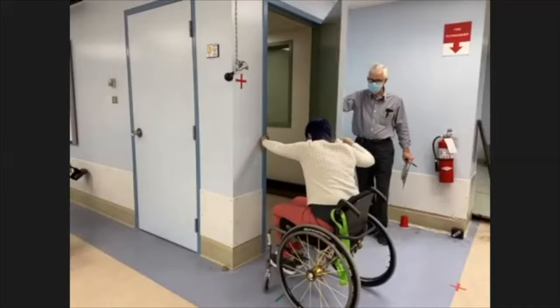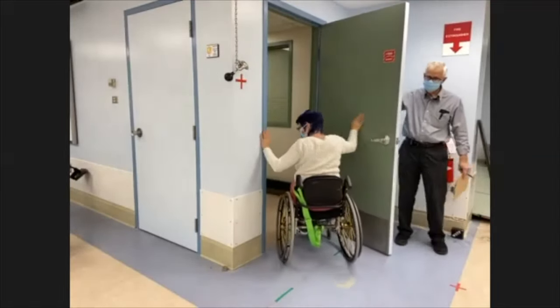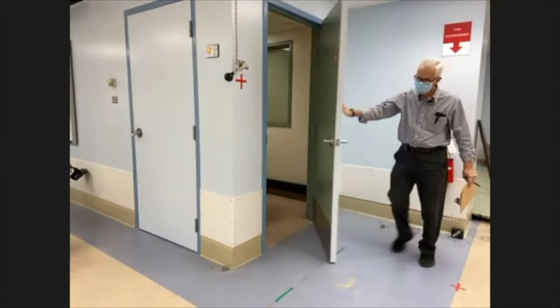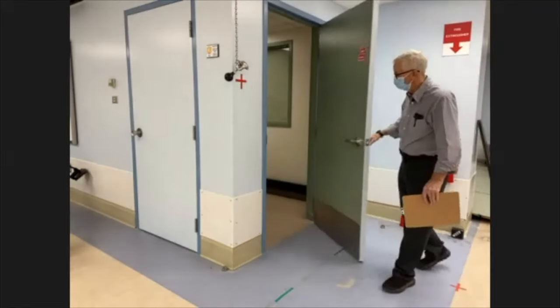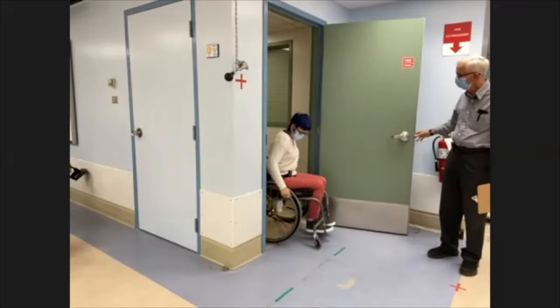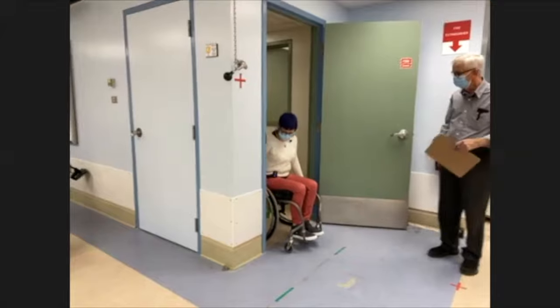Sierra talks through her technique: the main thing to notice from her starting position is she moves to the side so there's enough room for the door to clear. With resistance against the door, she keeps one hand on the door and another hand on the door frame so she doesn't pinch her fingers, and then she goes through.